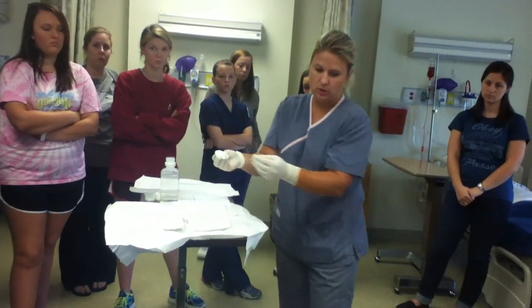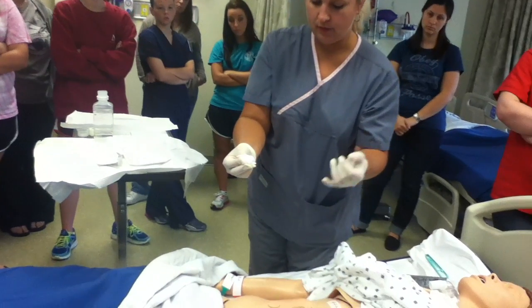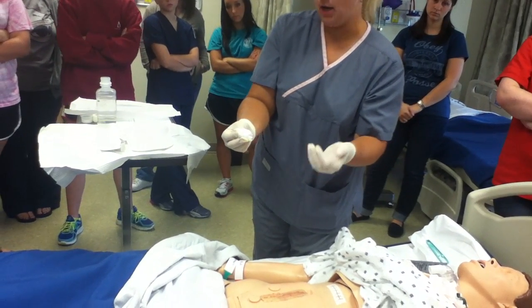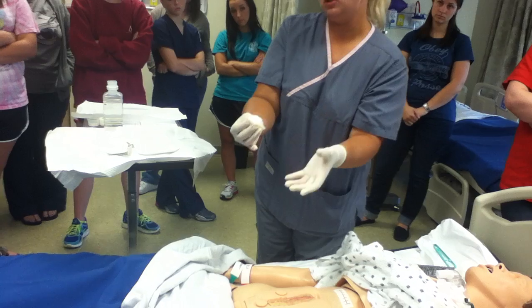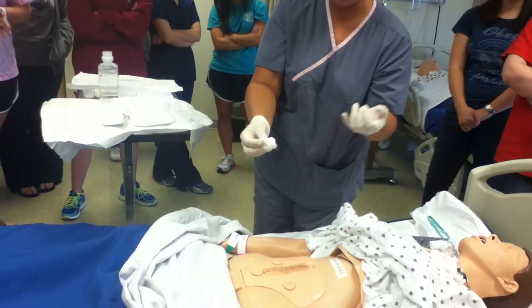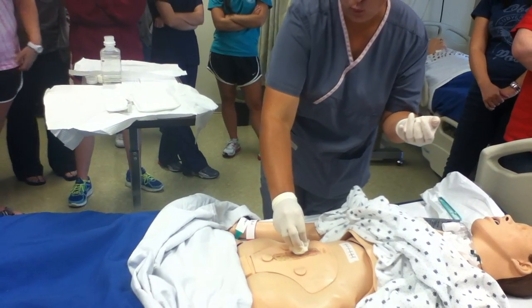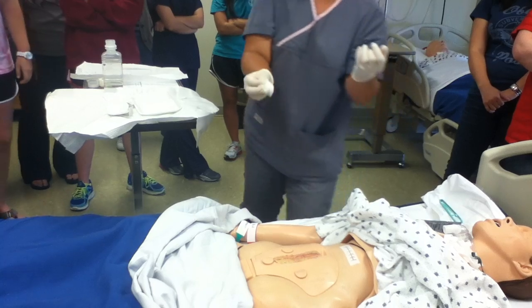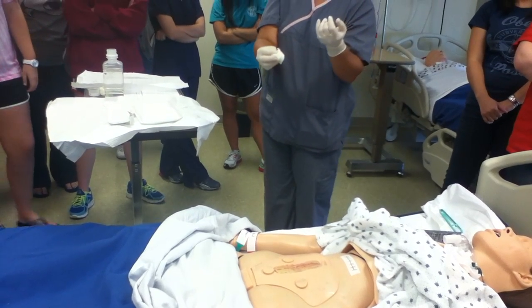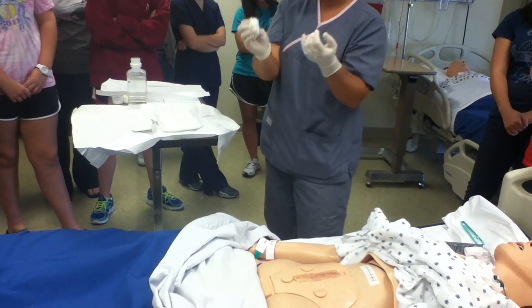So what I'm going to do is I'm going to clean the wound, okay? Now, this one is not wide open. In other words, it's not huge like those decubitus we were showing you guys. So what I would probably do with this one is I would start in the center and wipe out and then throw it away and get me another one. Now, since I only have two, I'm going to use this one again, but let's pretend it's a new one.